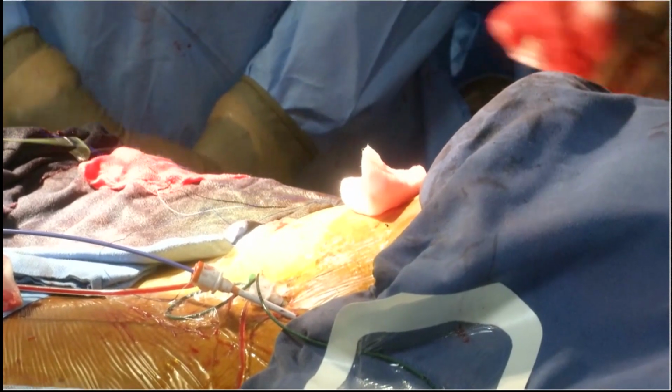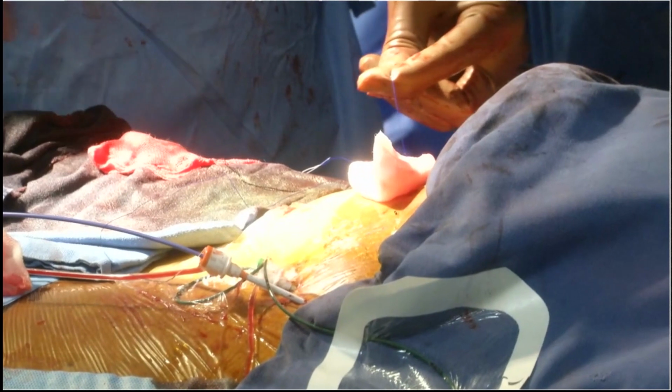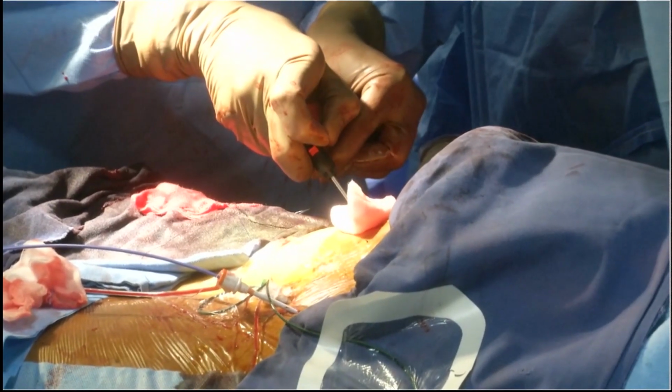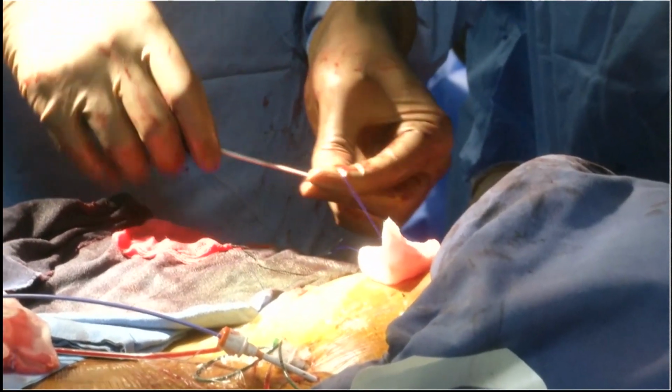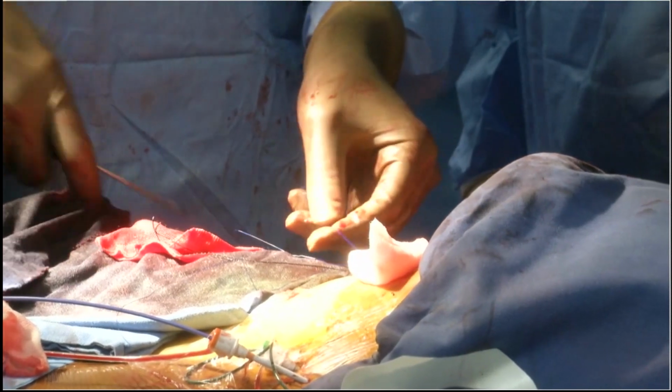It depends, but in some cases we do an angio just to be sure that everything is okay when we have a doubt. In other cases, and it is the majority, we just remove the wire and make the final control injection of the femoral. We use the transradial approach for that.